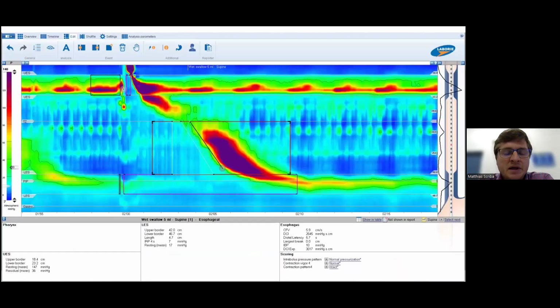And this is now what high-resolution manometry looks like these days. So this is a manometry from a solid-state catheter that we used. And what you can see is a basic image of one swallow. On the side here is the legend for pressure. So the more red and purple it gets, the higher the pressure. On the x-axis here is time, okay? So you can see here it says 1 minute 55, 2 minutes, 2 minutes 05. So this segment here is a 10-second segment.